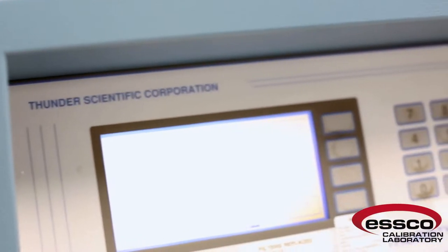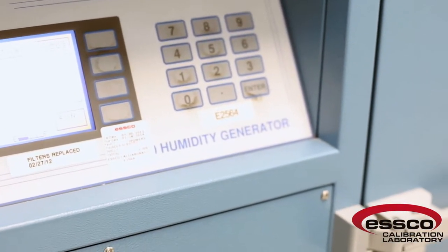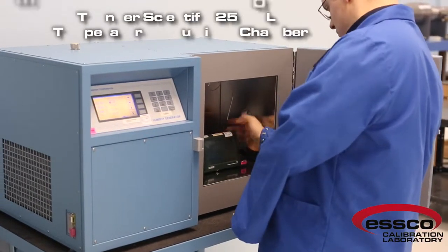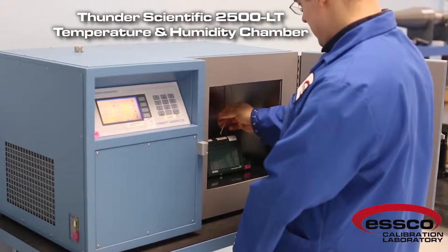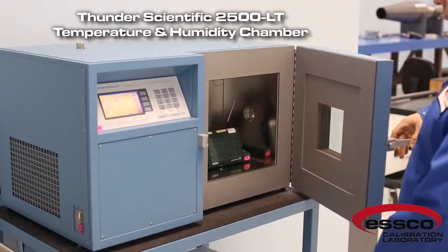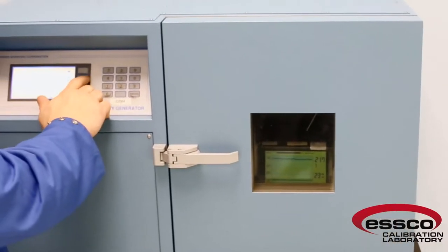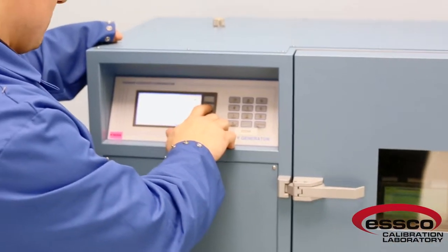For temperature and humidity sensors like data loggers and handheld units, we use our Thunder Scientific Temperature Humidity Chamber. The Thunder has a temperature range from minus 20 to 70 degrees C, with 0.06 degrees C accuracy, and a humidity range from 10 to 95% humidity, with 0.5% accuracy.